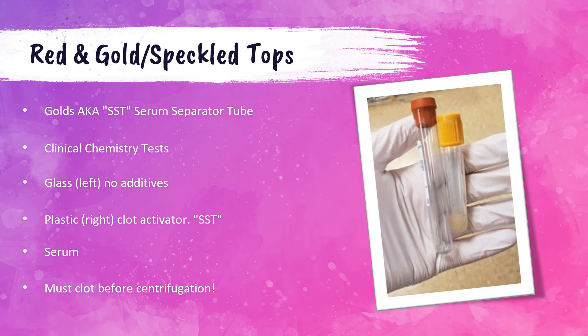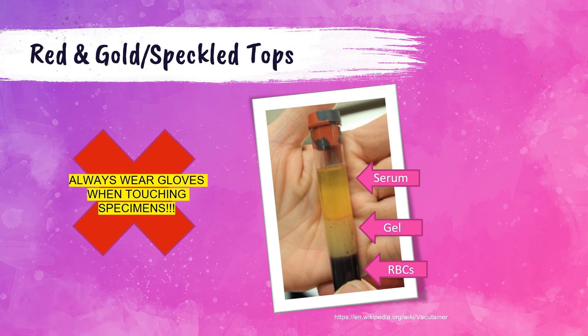Next we have the red, gold, and red-black speckled top tubes. The red top on the left is made of glass and has no additives in it. The gold top on the right is often called an SST or serum separator tube — at the bottom there is a small amount of gel that separates the serum from the blood after centrifugation. The gold top has a clot activator and must clot before it is centrifuged. It is used for chemistry testing and produces serum, which is the liquid portion of the blood left over after clotting.